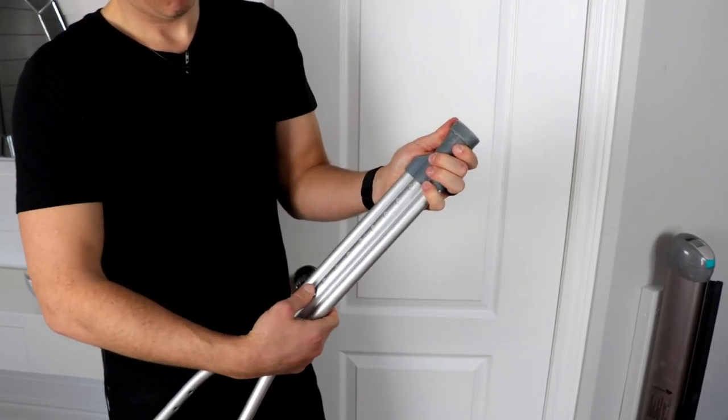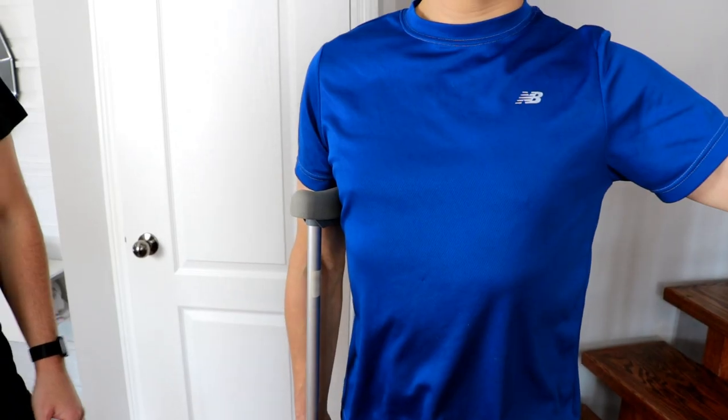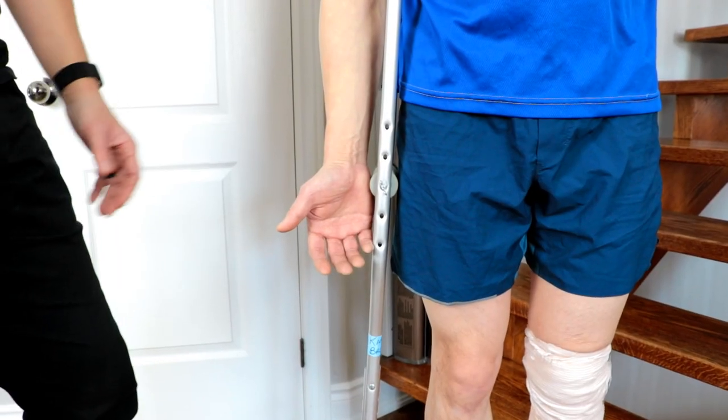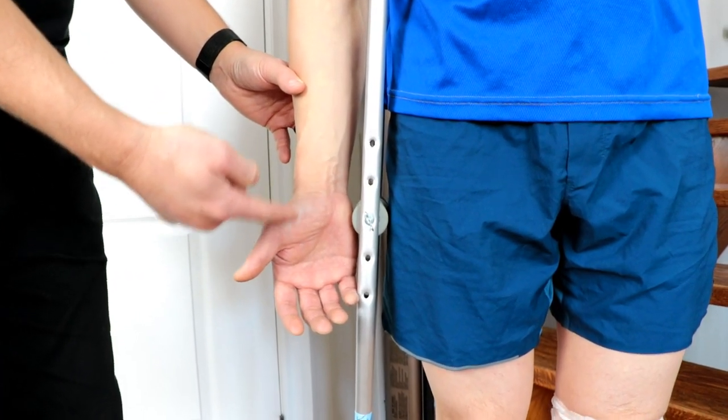The first thing to consider is that the crutches are adjusted to the appropriate height. The axillary pad should be a few fingers away from the armpit when standing, and the handle should line up with the crease between your hand and forearm.